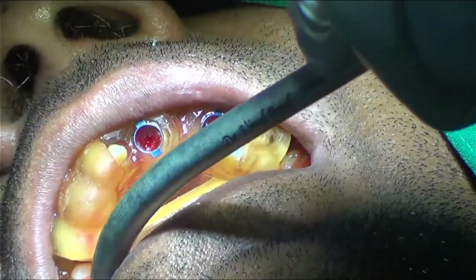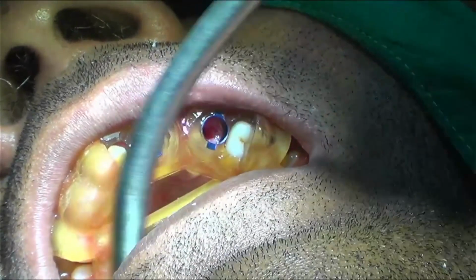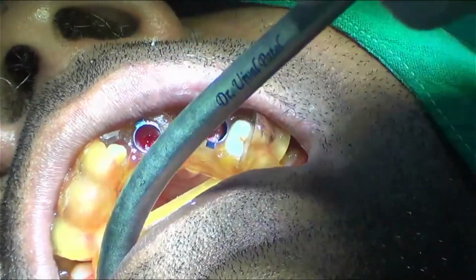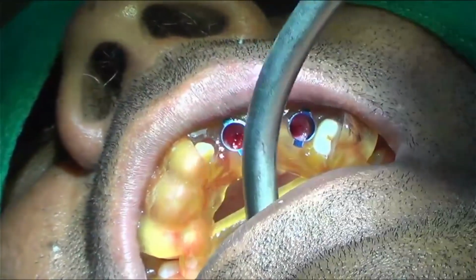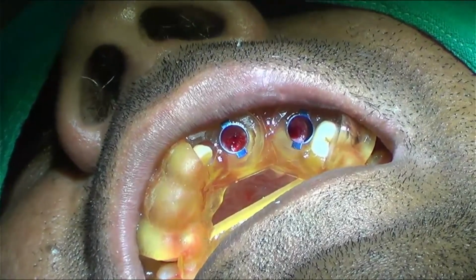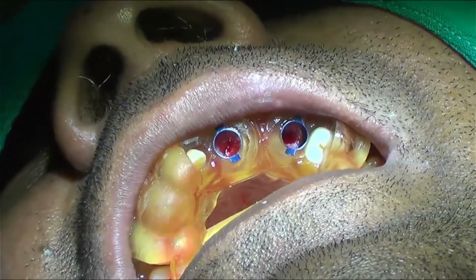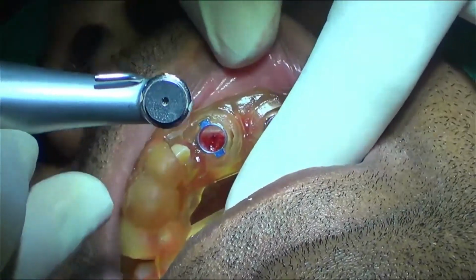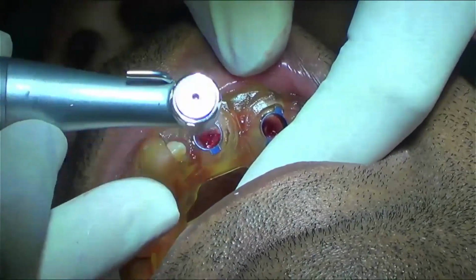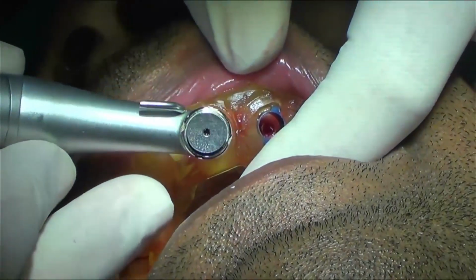After 2.7 into 5, it is 2.7 into 8.5. You see here, if I start my drill like this, then I can wobble and vibrate.